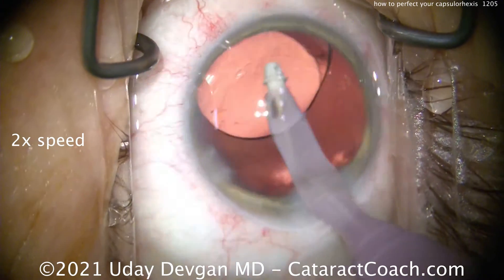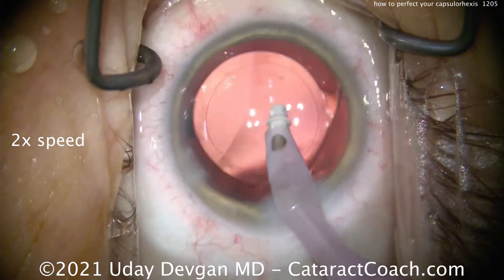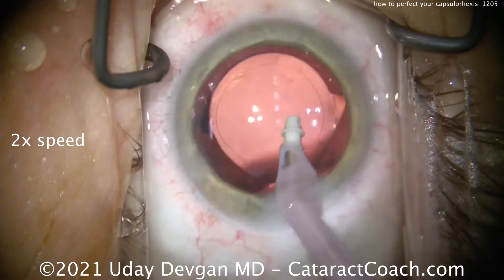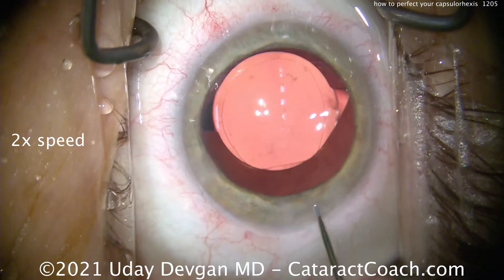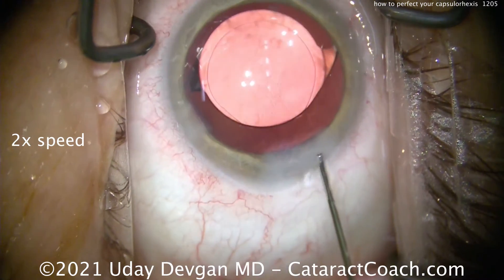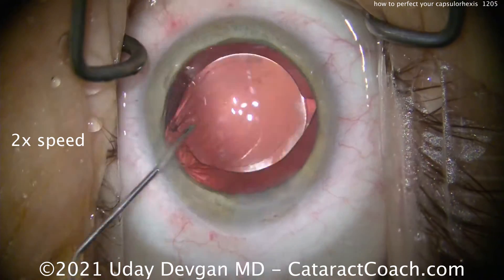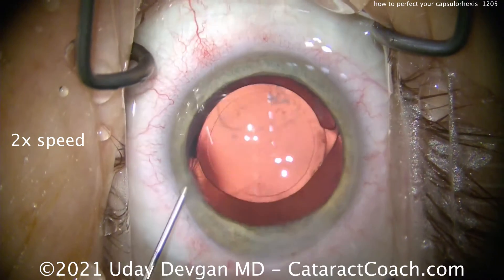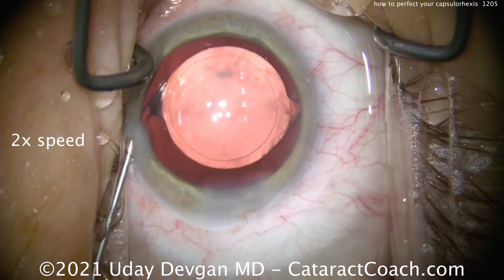The key is to avoid that widow's peak. If you look at an eye at this stage where you see the capsular rexis, and you can see that one widow's peak — in other words, where you brought it in too soon instead of continuing the curve — it will still overlap the optic, it'll still be a fantastic result, the patient will still see great. Arguably there's no difference, but you're passionate about this stuff. I have to make it as perfect as possible; I just have that obsession, that compulsion to make this look beautiful. And there you go — look at that rexis overlap.